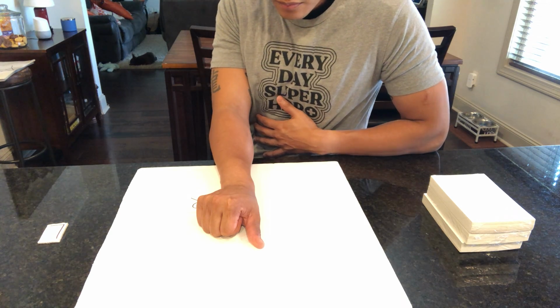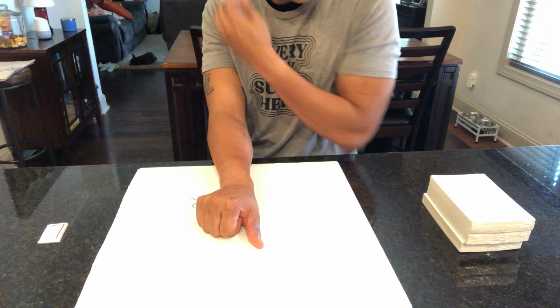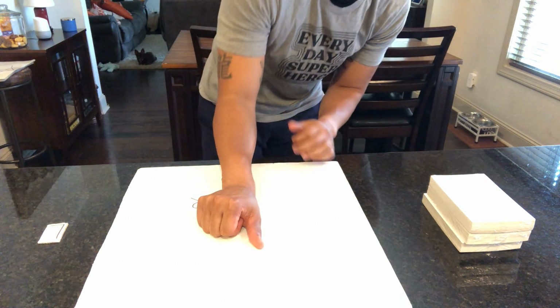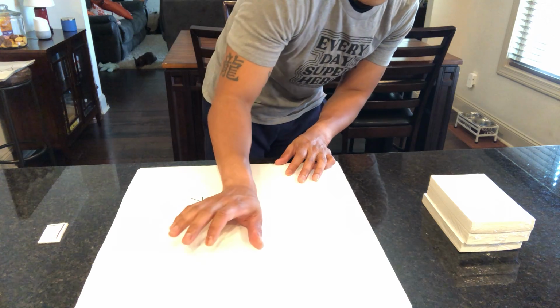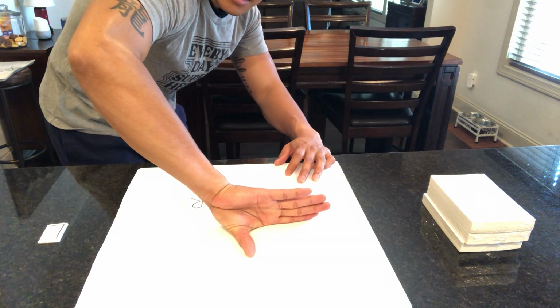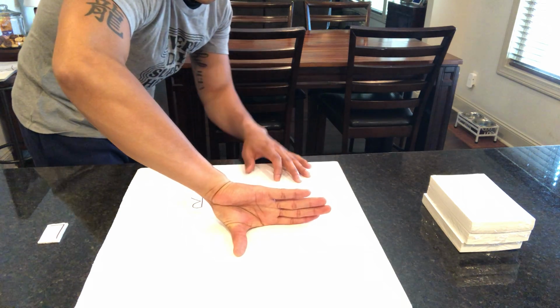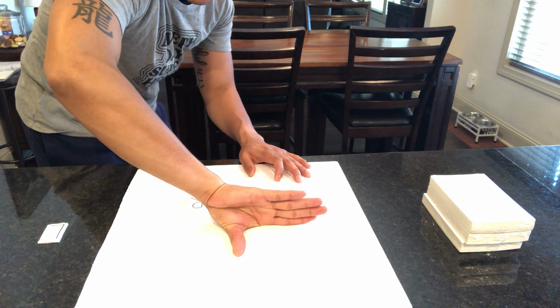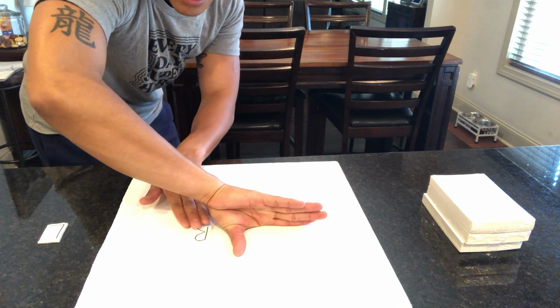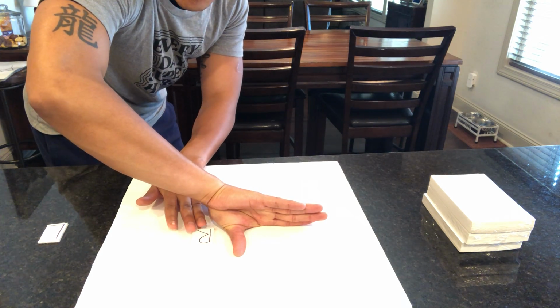Now, next we're going to do the AP thumb projection. It's a little bit tricky, so you have to instruct your patient and kind of show them what they need to do. But basically, you're going to roll the thumb or roll the hand to this type of motion. Again, we want the marker visible.